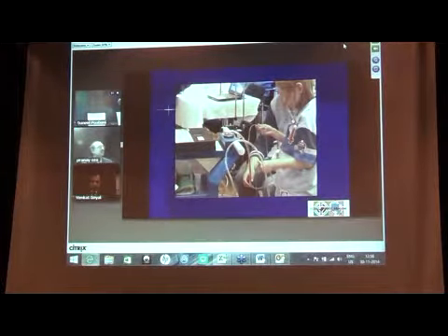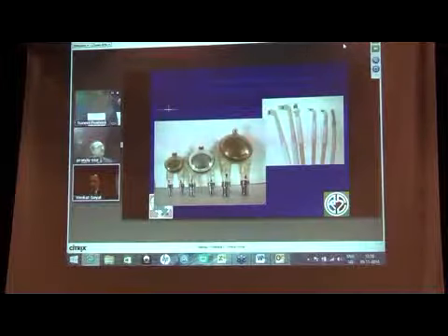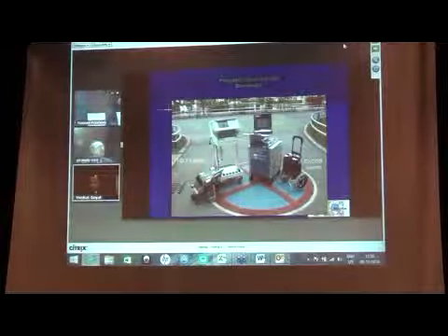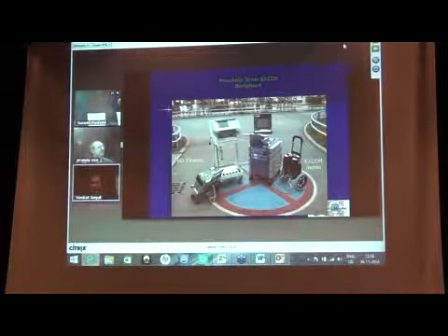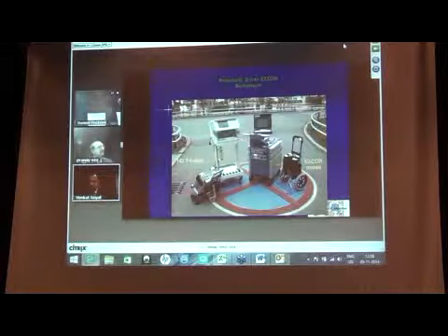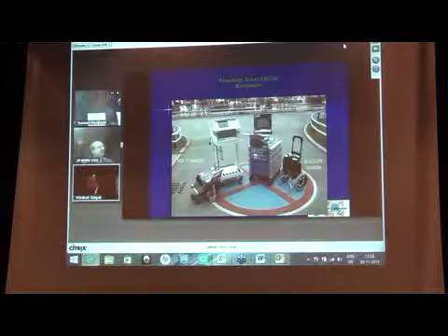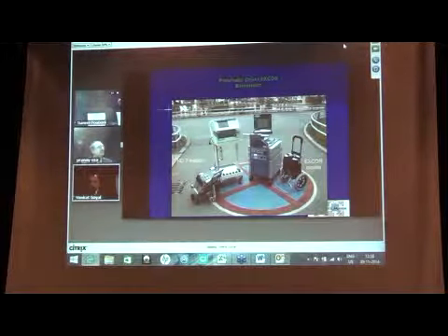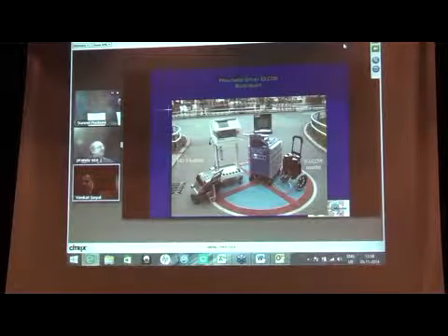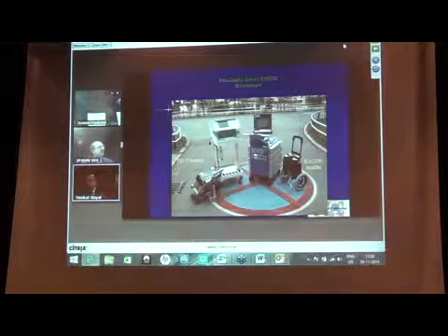Then these are the various sizes of extracorporeal devices, the various cannulas in the aorta. Then this was the complete unit required. This is like the pneumatic system. Then it got miniaturized to the size of a briefcase. Then these are the two pneumatic pumps put on a wheel, and the patient used to carry them with them. From a big console bigger than the size of the almirah, the thing got modified and compacted to the size of a briefcase. But they require a console, a computer, and a pneumatic chamber connected by tubings, which go inside to the intrathoracic pneumatic pump chambers, which are sucking and pumping blood.